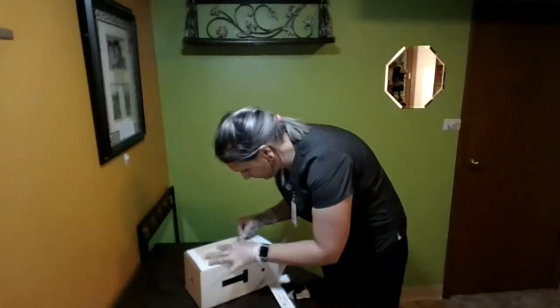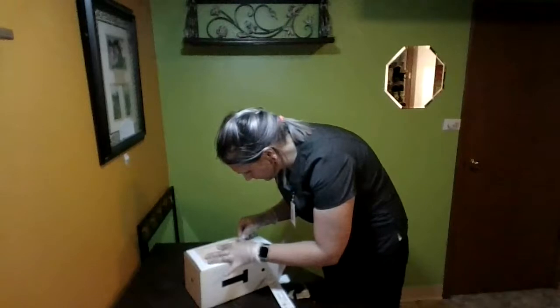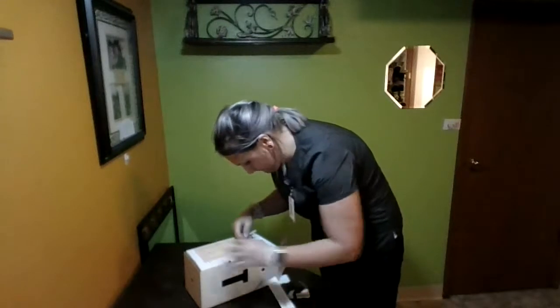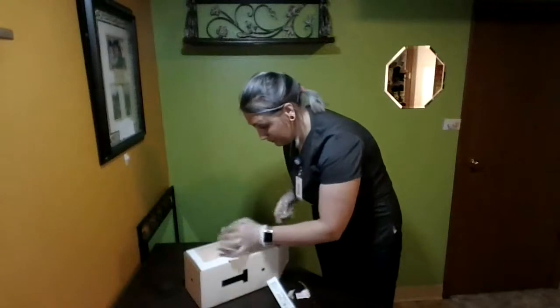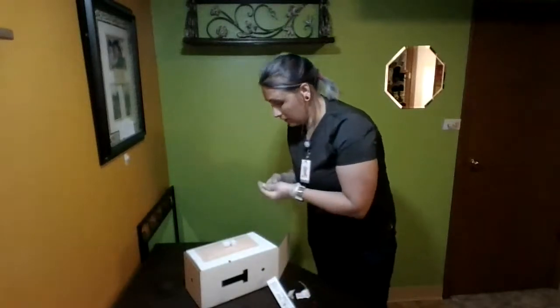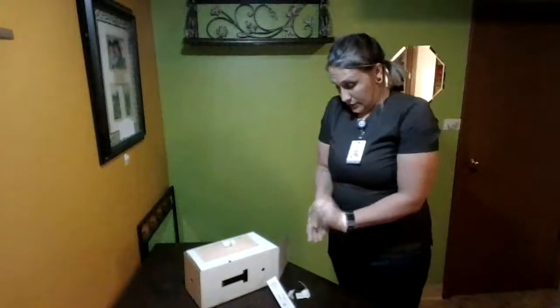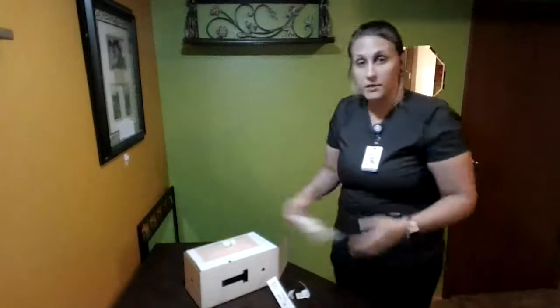Bevel side up at about a 5 to 15 degree until I get to resistance. And I notice a bleb forming there. Do you want a Band-Aid? No? Okay. So I'm going to go ahead and dispose of my needle in a sharps container. And I am going to take off my gloves, wash my hands, and document my findings.